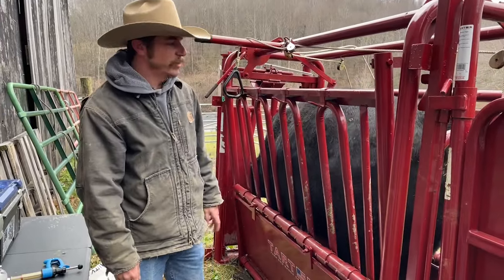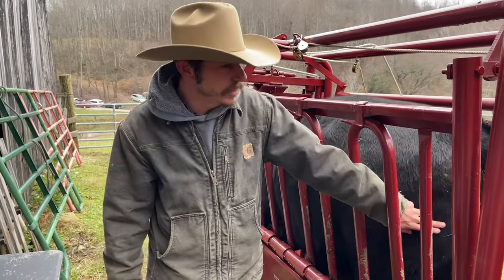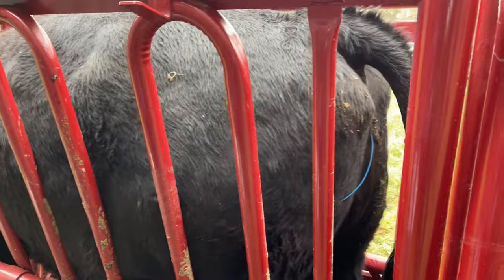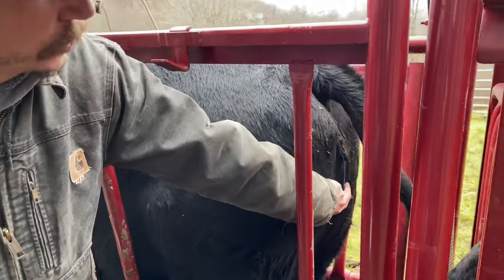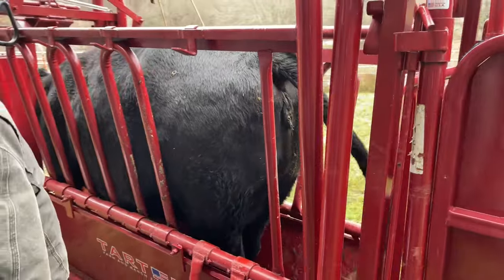It's been seven days since we put our seeders in. As you can see, they're still in there — that's what we want. We're coming back to pull these seeders, and it's pretty simple. You just take the little blue string, wrap your finger around it, and pull it out. Simple enough.